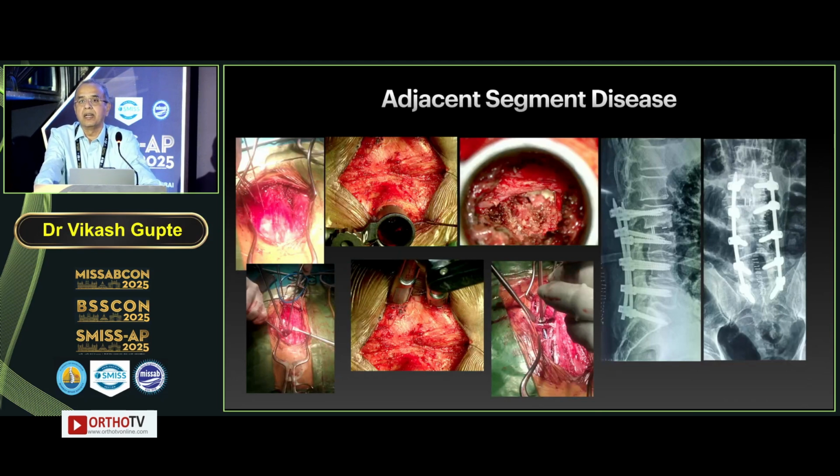What I do is take a midline incision through the old scar, don't dissect muscle, just fascia, and then the fascia is retracted and you pass your screws percutaneously. Where there is an old implant, you can go paraspinally, remove the implants and pass using the same track. In this case, we used the same track to pass a guide wire, and over that we passed the percutaneous screws. Even the tube is passed percutaneously like a muscle-splitting approach, and through that the cage is passed. This is also almost 8 years follow-up.